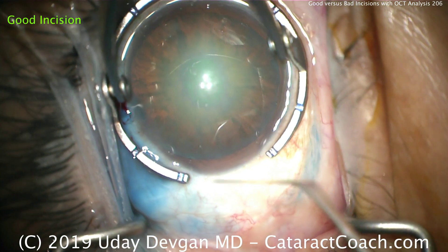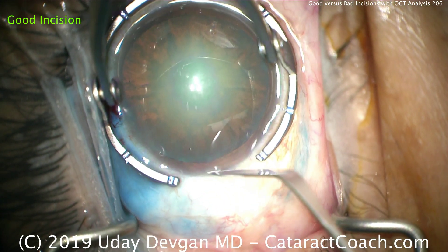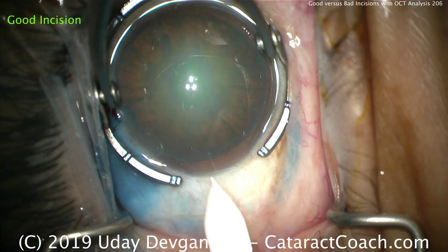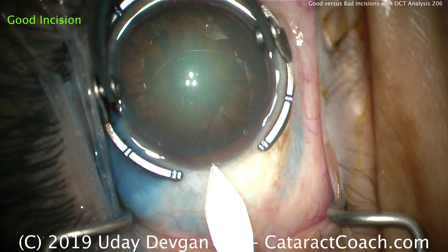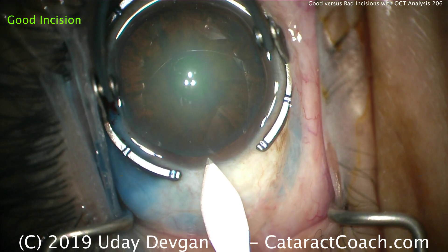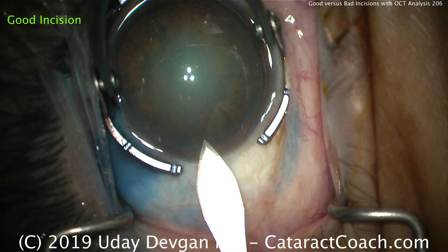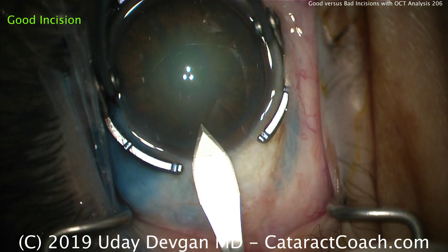This is CataractCoach.com, and we're watching a beginning surgeon making fake incisions. There's a light groove that helps delineate the starting point of the incision. The tip of the keratome is placed in there at an appropriate angle, taking care to make sure that the roof of the incision is going to be balanced with the floor.